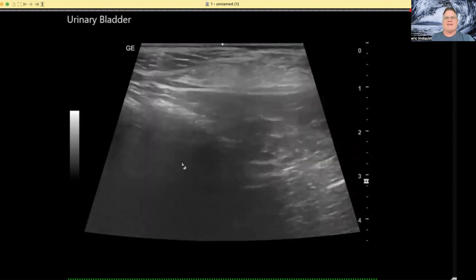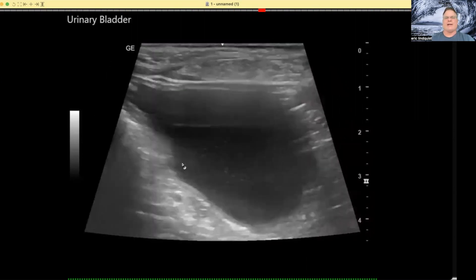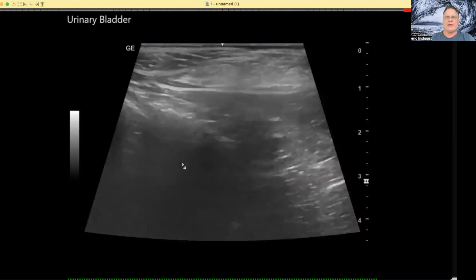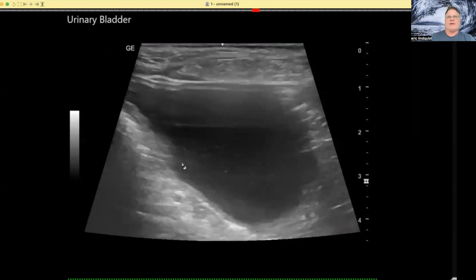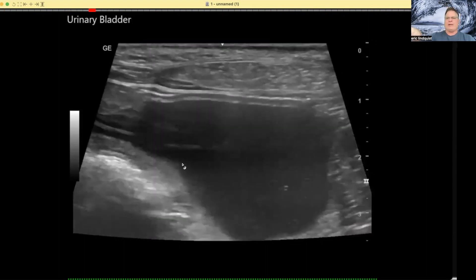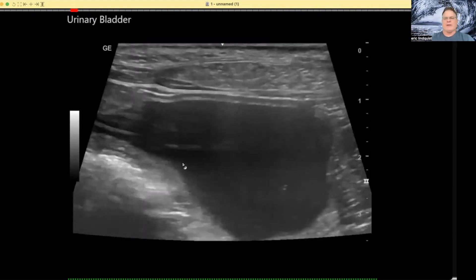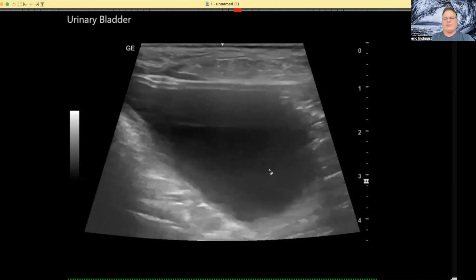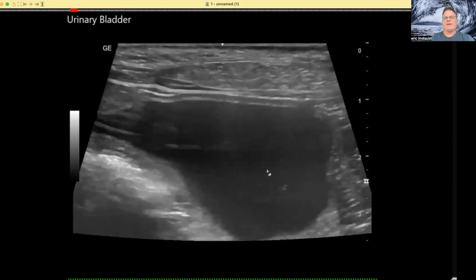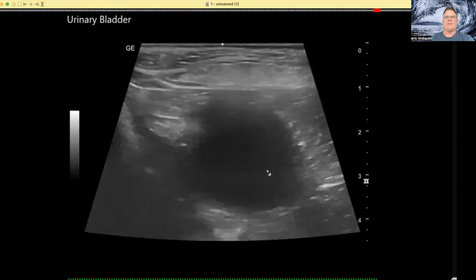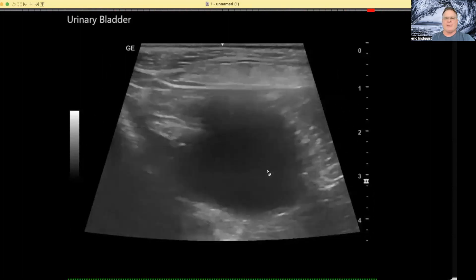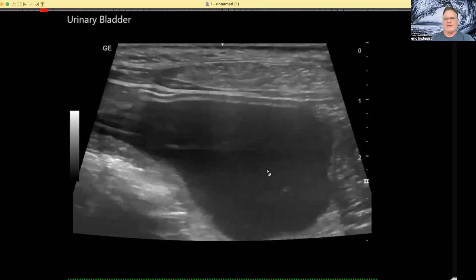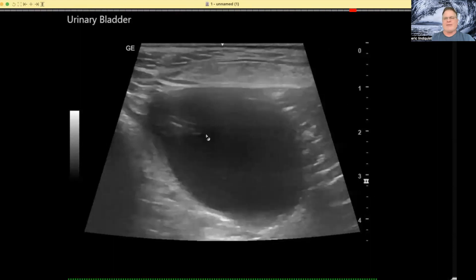In patients that have lower urinary tract signs, you always need to get into that pelvic urethra as far as you can. It's a twist, it's a tilt, it's a slide — pronate your wrist to get back into that pelvic urethra. If you're just imaging the urinary bladder, you are missing lesions, I guarantee you. The S-DEP pelvic urethra pathology is probably the number one, second, or third opinion pathology that I see sonographically when I look at cases that have already been scanned, and they often get missed.